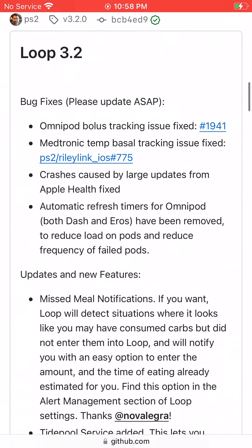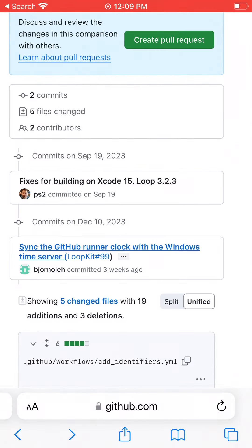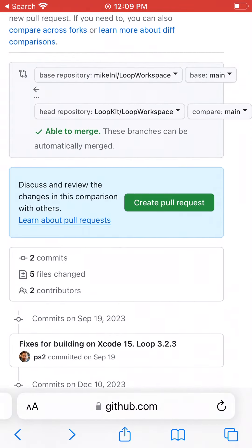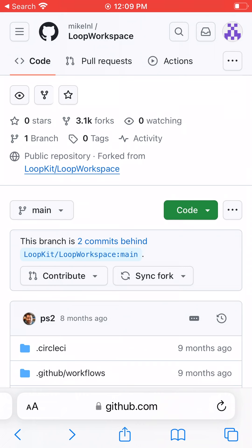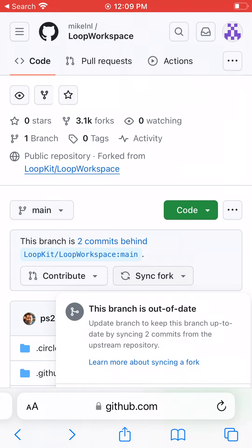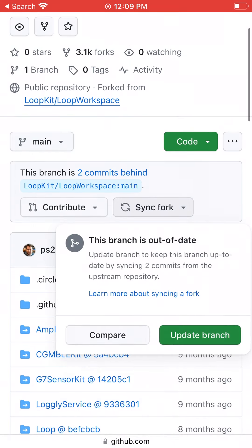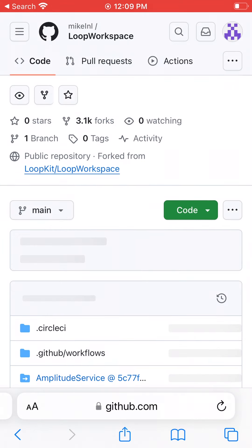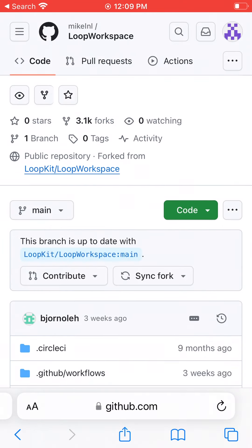Let's go back a couple pages and hit Sync Fork, then Update Branch to bring our Loop to the latest version. You should see it now says 'This branch is up to date with the main branch,' which is what we want.